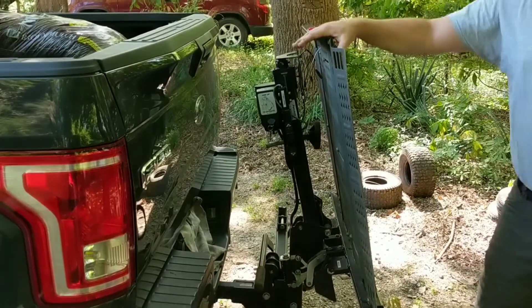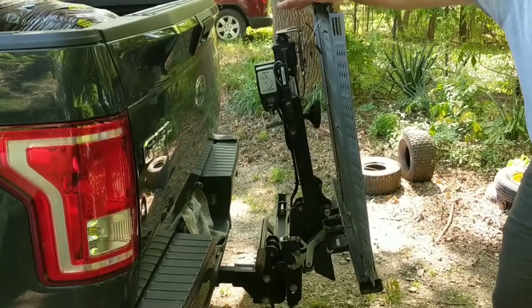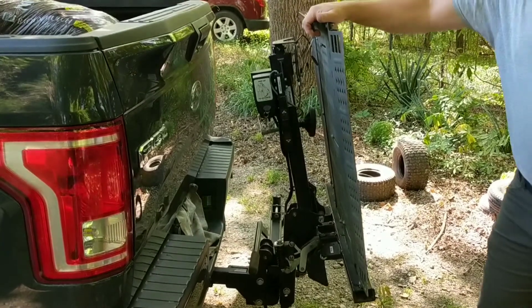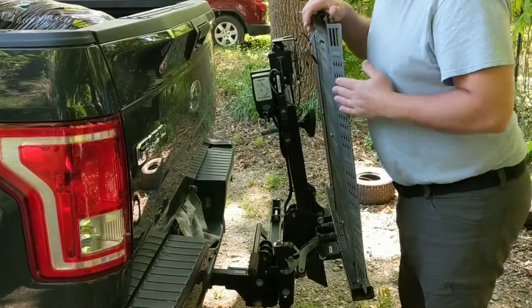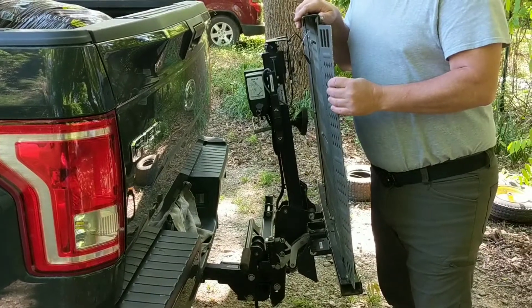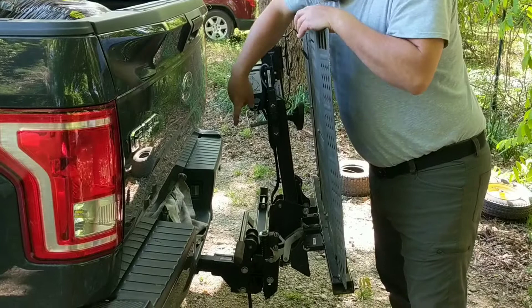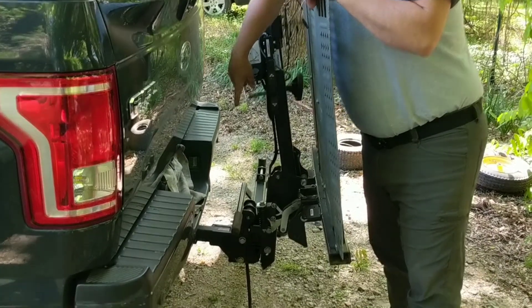We're going to do a quick demonstration of this mobility scooter lift. It is the Bruno model ASL-250.